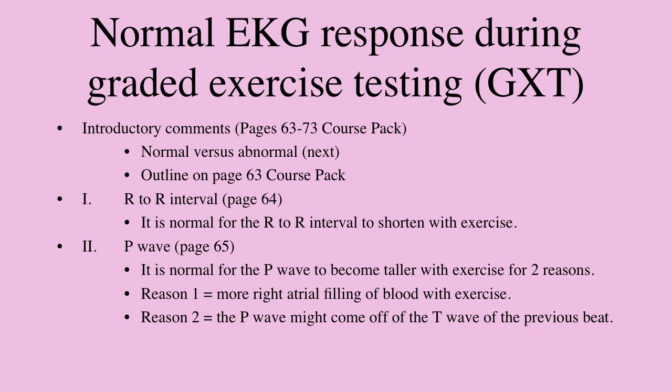Response During Graded Exercise Testing, if you go to that first slide. With some of the abbreviations here, graded exercise testing is usually just called GXT, and I'll refer to it as GXT throughout. That just means that you are not necessarily on a treadmill grade or anything, but it could be on a treadmill or a bike or anything, and you're just adding work to the test, making the test harder throughout. So you usually have stages: stage 1, stage 2, stage 3, and that's referred to as a GXT.